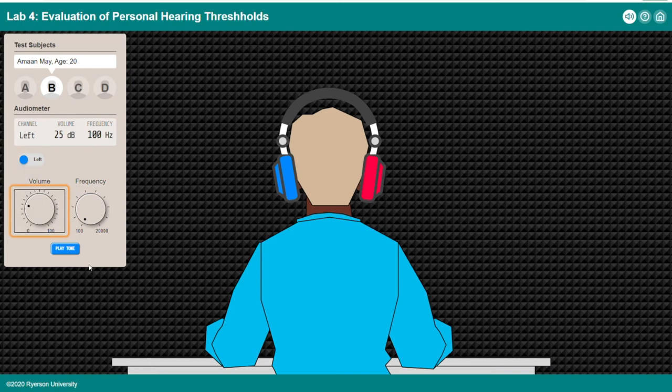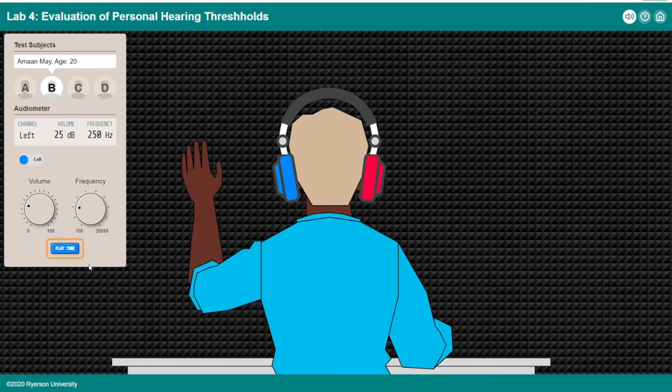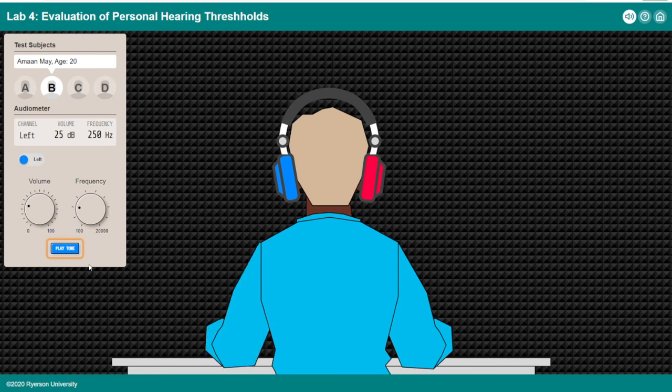Volume set to 25 decibels. Frequency control: use arrow keys to change — 150 hertz, 250 hertz. Play tone button: not pressed, then pressed, then not pressed. Subject raised left arm.